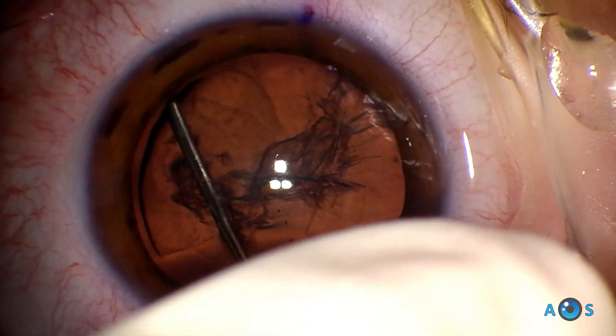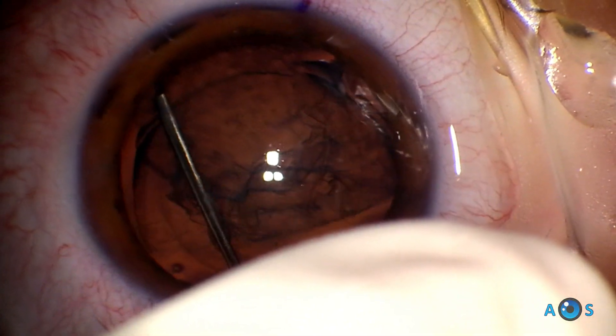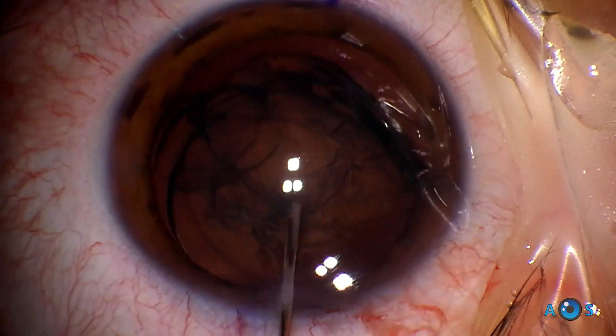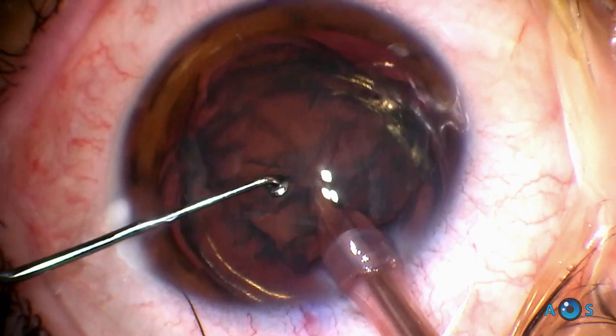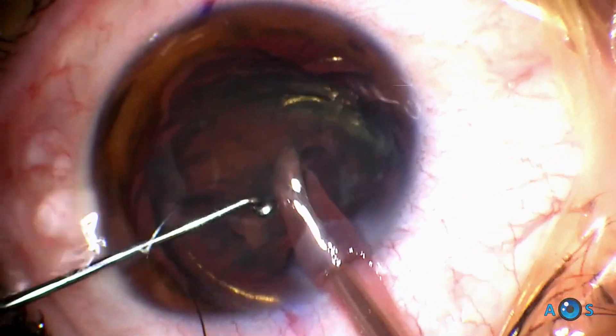Once the rhexis is complete, phacoemulsification technique proceeds as standard. For softer lenses, the tilt and tumble is a very safe technique. For dense cataracts, chopping techniques are favored.